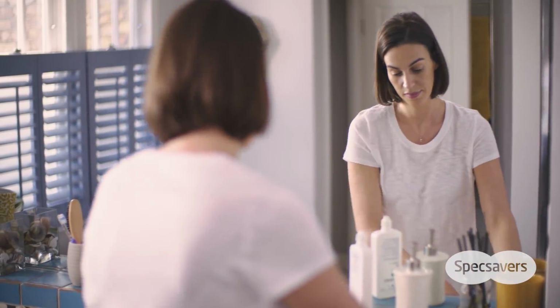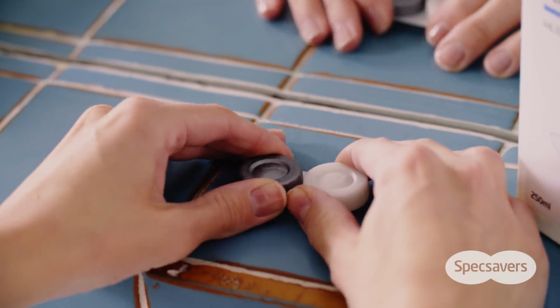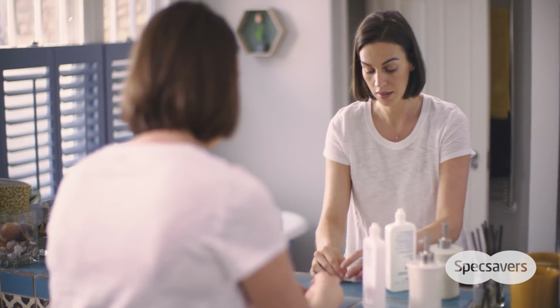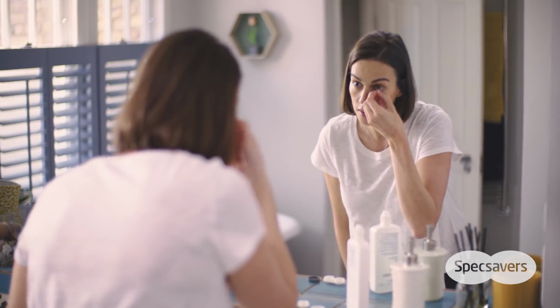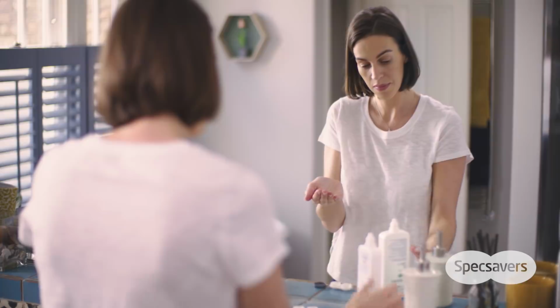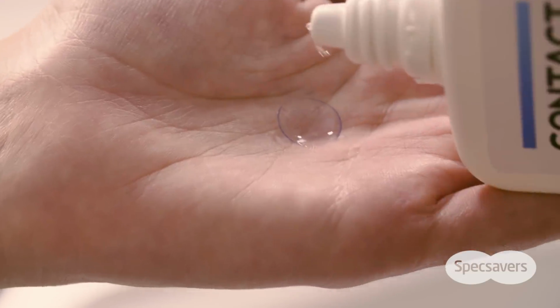If you wear reusable contact lenses, you'll need to clean them with a solution. Be sure to follow the instructions on the bottle as well as this video, particularly if you use hydrogen peroxide solution. That's the one with the red bottle top. If you're unsure of anything, then pop into your nearest store and they'll be happy to help.